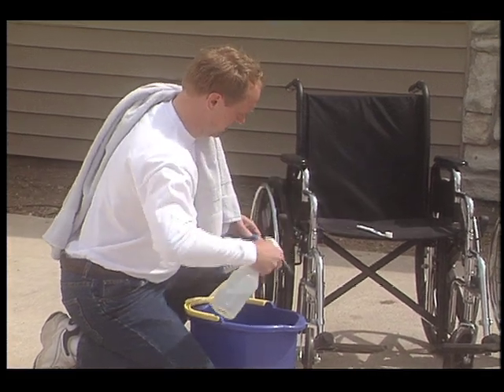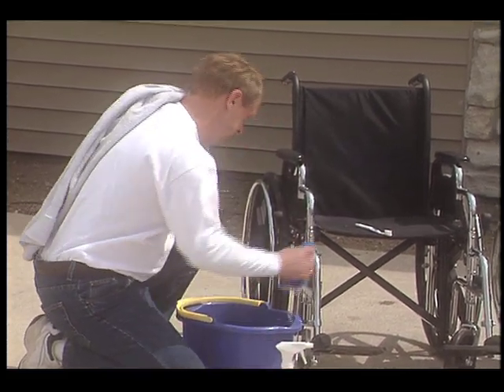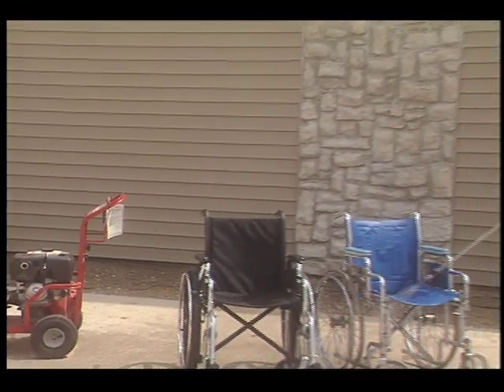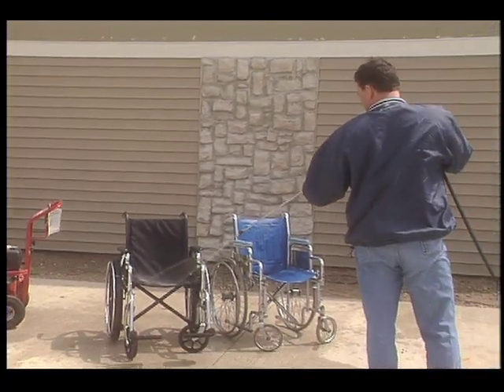Are you tired of trying to get employees to wash and disinfect wheelchairs? It's an unwanted job. Employees end up wet, chemicals are being handled unsafely, and it takes too much time.